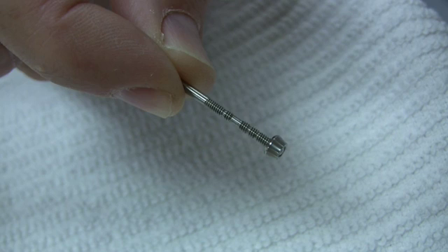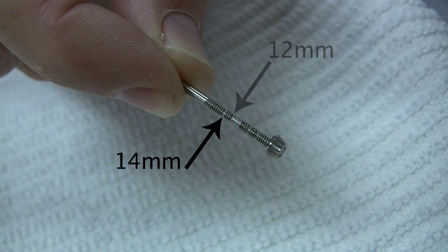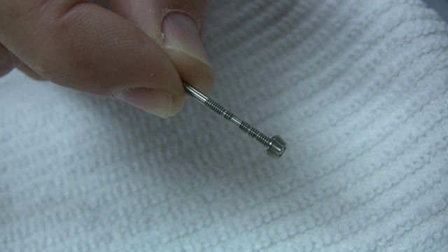A thread has been left off the probe to indicate 6, 8, 10, 12, and 14mm depths, coinciding with the markings on the implant drills.